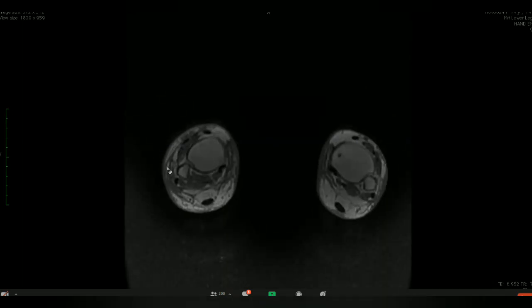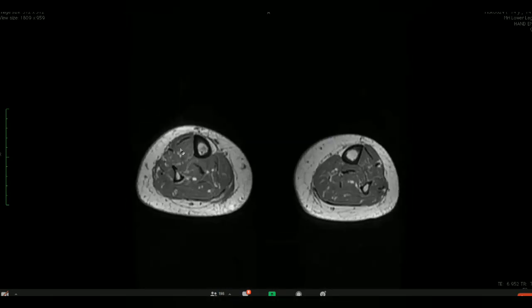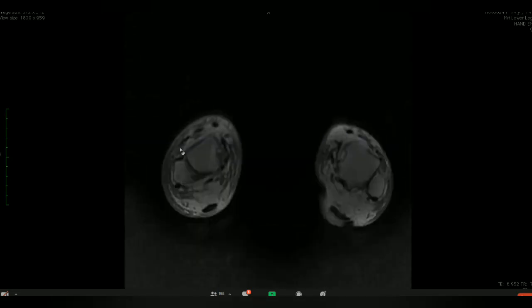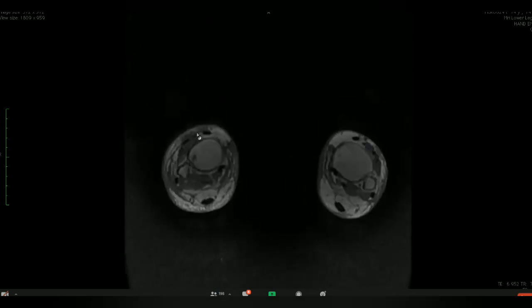So, as a radiologist, what would be your first thing to do? What would you do first? The surgeon is standing there and he's asking, now what? So we can stage the disease process by offering an ultrasound abdomen or even a CT abdomen, and stage the entire disease involvement. And also, I would like to refer the patient to the multidisciplinary team to decide whether to go for chemotherapy. Correct. You've actually got it, well done.